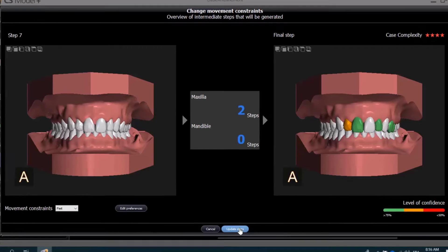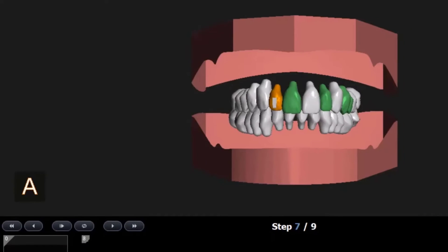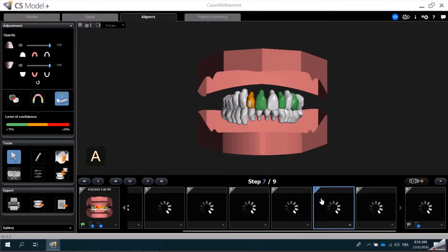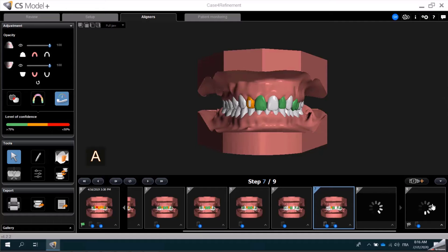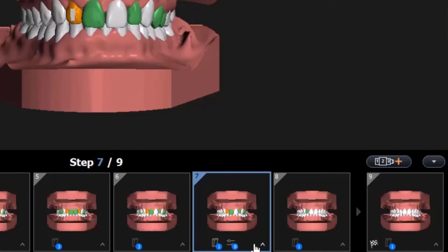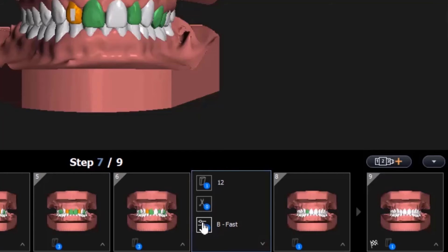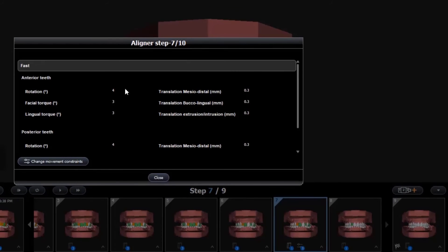I can click Update the Steps, and the software displays a warning that it is about to recalculate the treatment simulation. I'll click Yes, and CS Model Plus will recalculate the steps, and now you can see we have a total of nine steps. You can also see that we changed the Movement Constraints from Classic to Fast, as indicated by the letter B, and I can view the changes in the Constraints window.